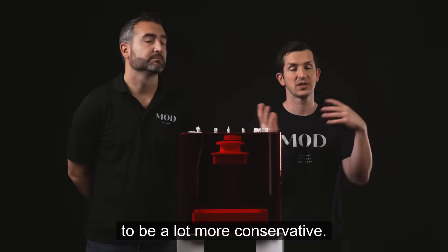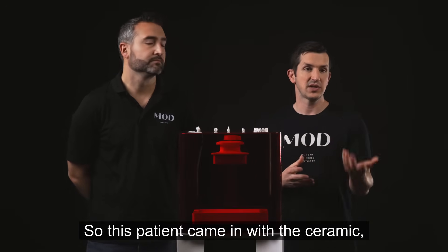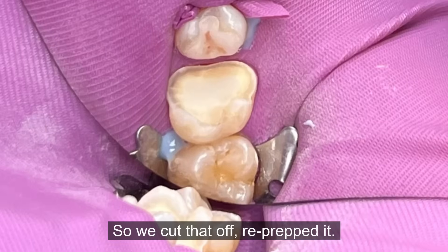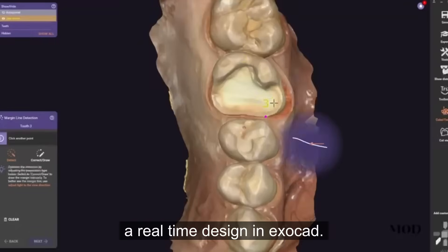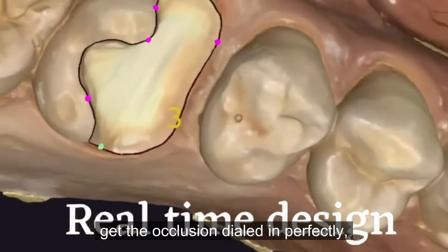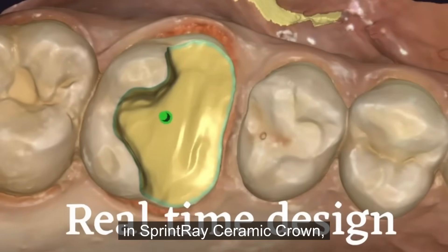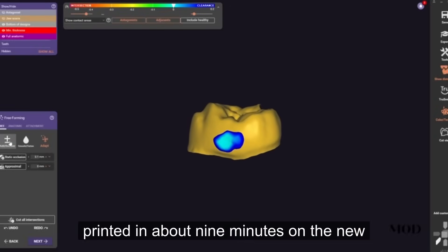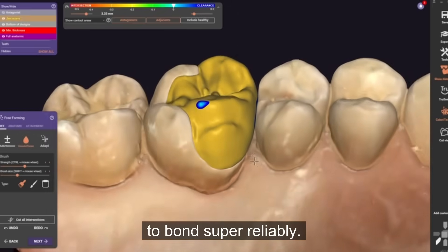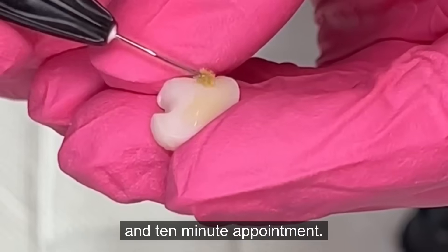I love printing for this indication because it allows us to be a lot more conservative and it doesn't limit the geometry of our prep styles like milling does. This patient came in with a ceramic only crown, had to have endo through it, so we cut that off and re-prepped it. You can see a real-time design in ExoCAD that took about three minutes to dial in the occlusion perfectly. We sent it to the printer and printed this in Sprintray Ceramic Crown in about nine minutes on the new fast build plate, then bonded it in. The contacts and occlusion were perfect, patient was super happy, all done in a one hour ten-minute appointment.